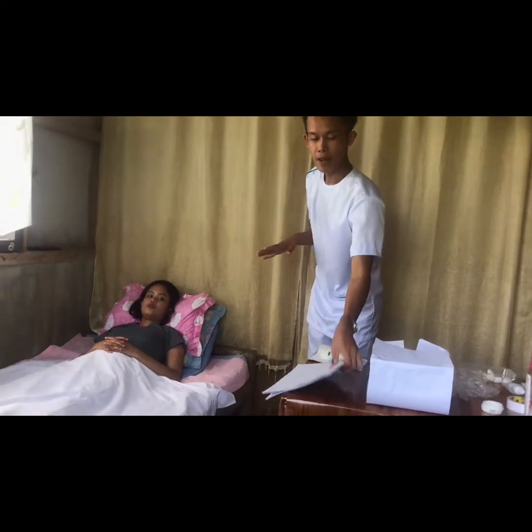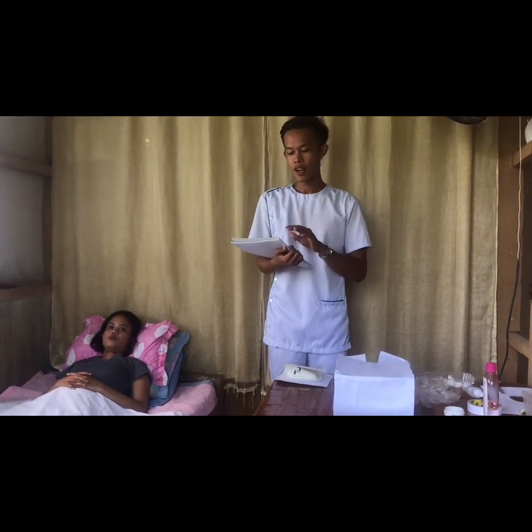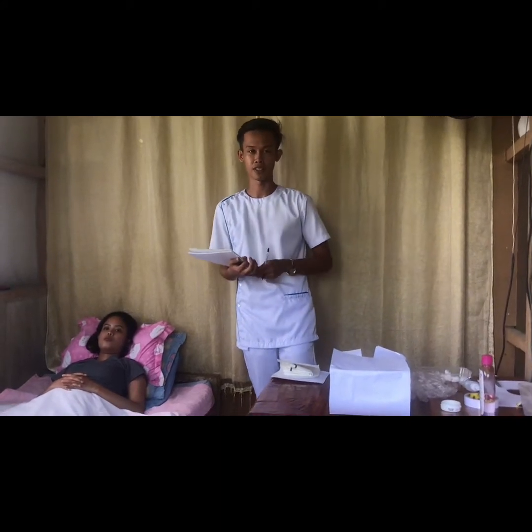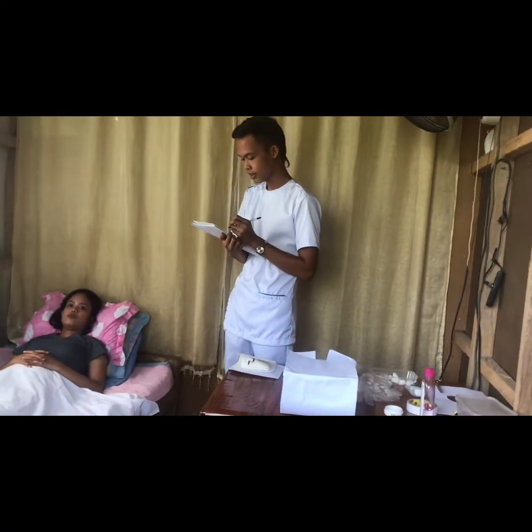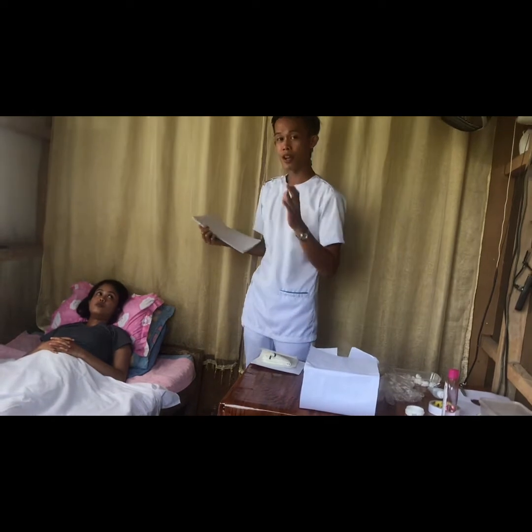So for this time, I'm going to compare it with the medical orders in order to confirm if he is the patient who is to have the catheterization, because we are not able to conduct catheterization if there is no medical order coming from the doctor. In the medical record, the patient's name stated is Lito Butan and the date of birth is the same. So I'm now confirming that the patient is able to have the catheterization.